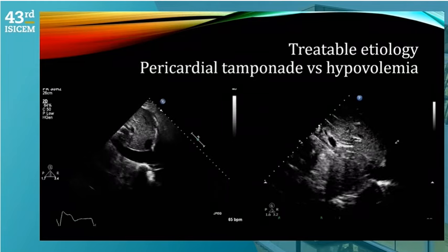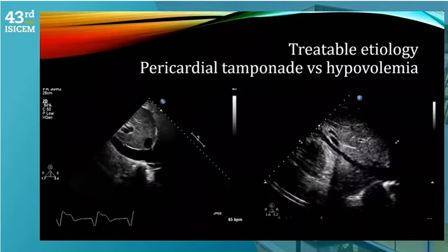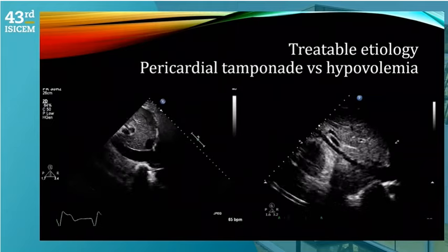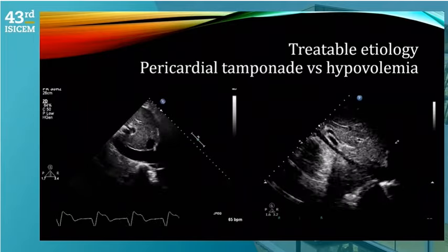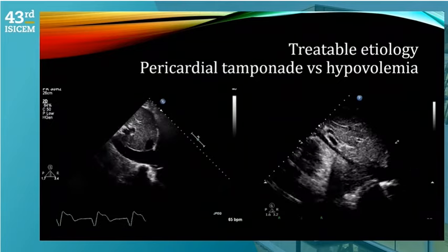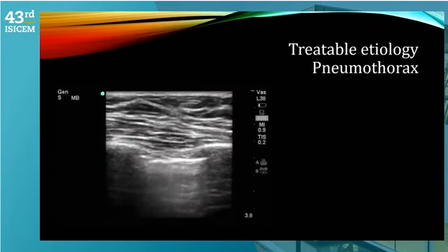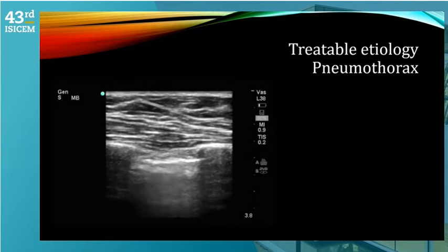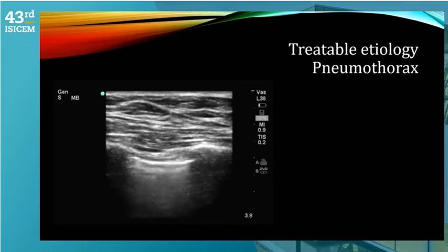If the subcostal views are difficult, IVC can be used as a surrogate. On the left you can see a plethoric IVC compared to the right where you have a collapsible IVC. These are indirect signs; in isolation they may not mean anything, but understanding the clinical context — even one supporting image — can be extremely helpful in directing attention to the cause. Another often treatable cause is tension pneumothorax causing cardiac arrest, especially if the patient had a procedural complication that could have resulted in a pneumothorax. Decompressing it can stabilize hemodynamics, and you can see a lung point in this particular case.